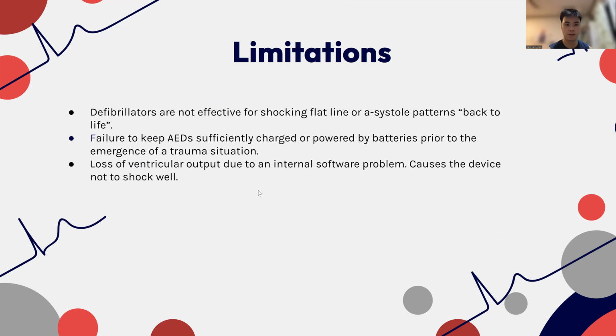Some of the limitations of the AED are that they're not effective for shocking flatline or asystole patterns back to life. Failure to keep AEDs sufficiently charged or powered by batteries prior to the emergence of a trauma situation. Loss of ventricular output due to an internal software problem. This causes the device to not shock well.